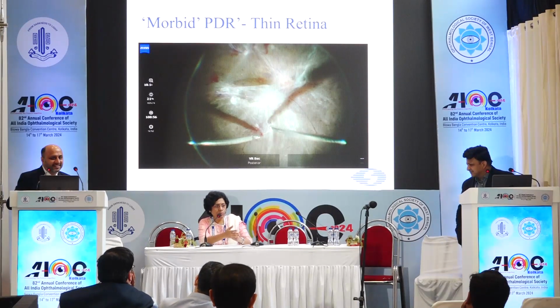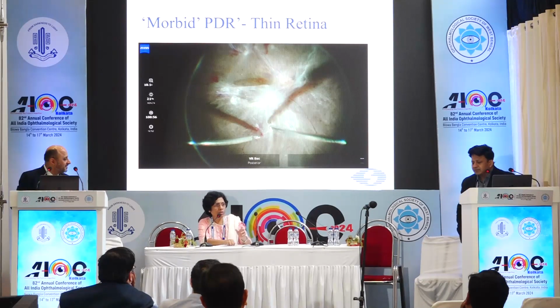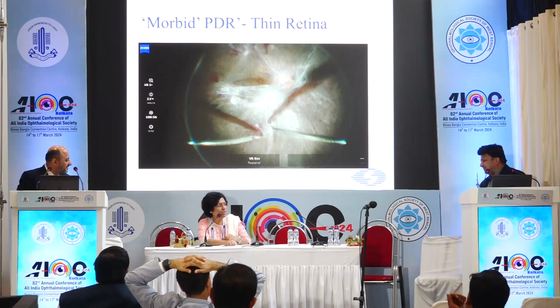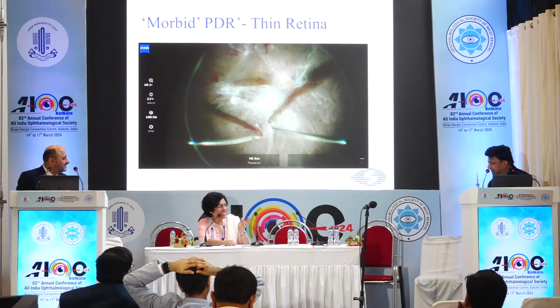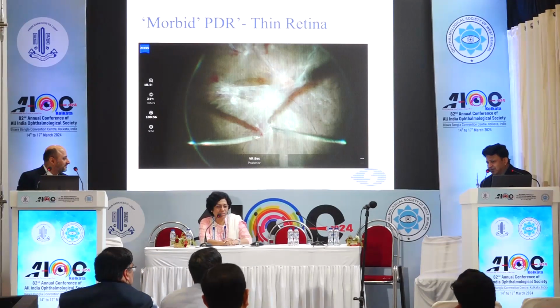But there are novice and young people, they really do not know when to leave the traction. And if a junior person is doing it, I am sure they will end up with peripapillary breaks. Because in my own experience, when I was younger and doing this center to periphery dissection, I myself have created breaks like that. So that is one thing I would like to caution the young people. What is your take on that?